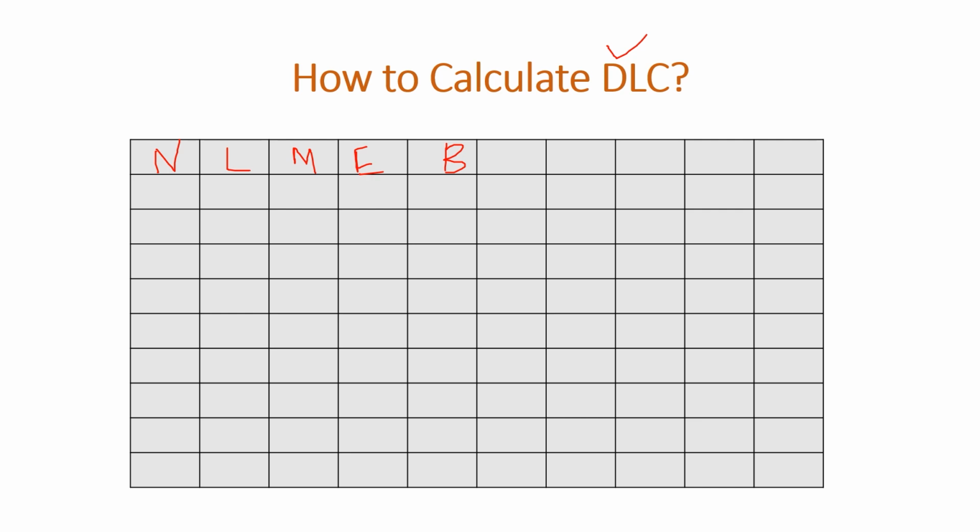I've seen people writing even R sometimes inside it. It doesn't make any sense because this box is differential leukocyte count box. It is a leukocyte count box. So leukocytes, don't write erythrocytes here. Don't write R, which is RBC.